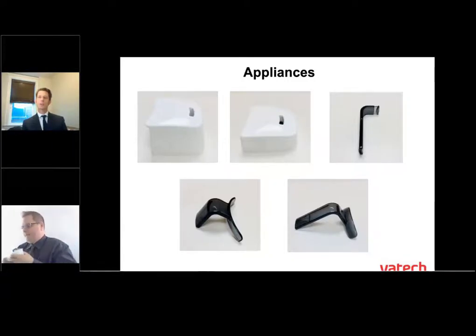You do have the option of the short chin rest. So Paul, let's hold that up against the two chin rests next to each other. I do have offices saying I need to capture into the ostium for implants, or I want to make sure I'm getting my joints. Note that the shorter chin rest is 2 centimeters shorter. Thus, we're going to lower the patient down, cutting off the inferior border of the chin, but we are going to transfer that further superior to capture further superior in the image itself. So that's the other option. And with that short chin rest, you always have to use that chin cup itself.